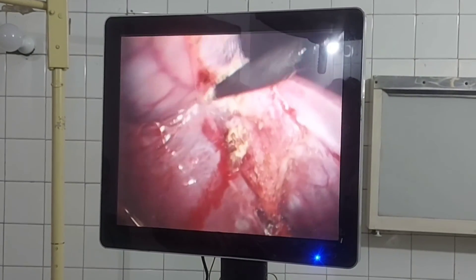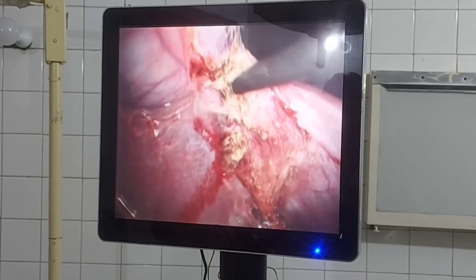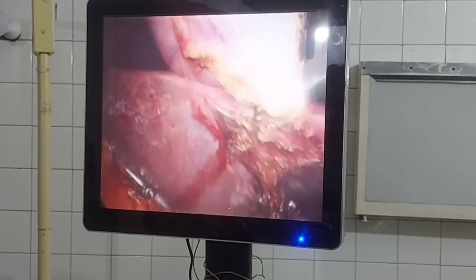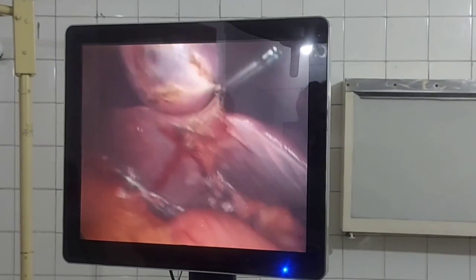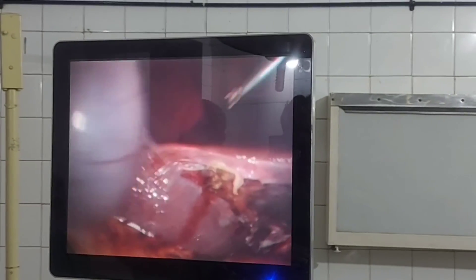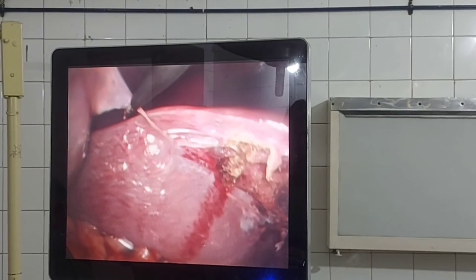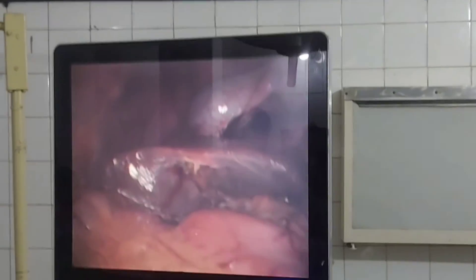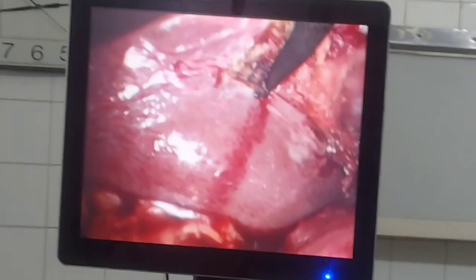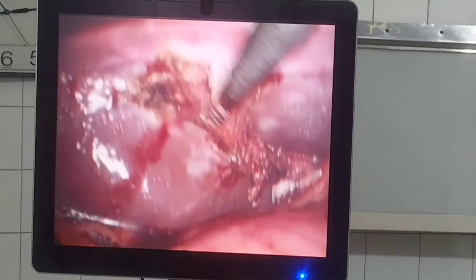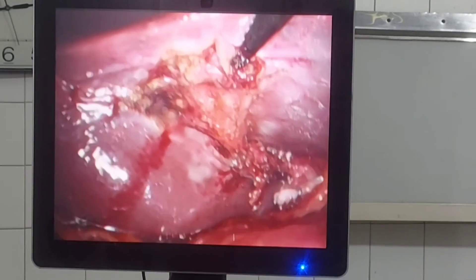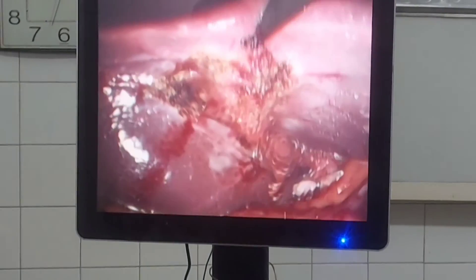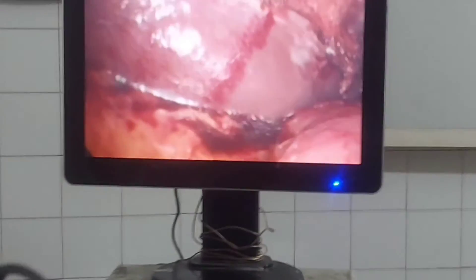Before removing the gallbladder fundus from the liver, hemostasis is secured and small blood vessels are cauterized. Bleeding points are also cauterized. Sometimes in the cystic plate area there are small blood vessels or small bile ducts of Luschka; if these are encountered, they should be ligated separately and proximally. The gallbladder is placed over the liver while hemostasis is secured, and any small bleeding points over the gallbladder fossa are cauterized.